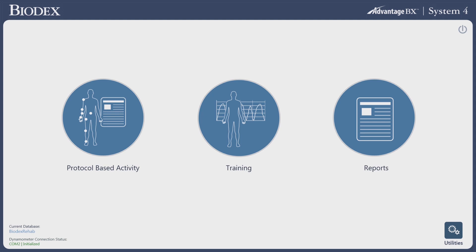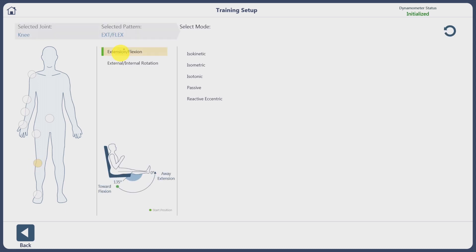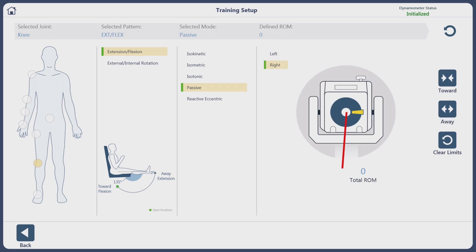It is a touchscreen interface. We're going to select Training. The next item is to select what joint you're going to work on today — we're going to pick the knee. We're going to do extension/flexion, starting the subject or patient in a passive range of motion, and we are on the right side at this point.